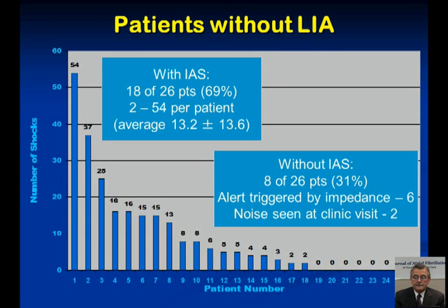In patients without the lead integrity alert algorithm, 8 patients did not receive inappropriate shocks. In these patients, the alert was triggered by the impedance change in 6, and noise was seen during interrogation at routine clinic visits in 2 patients.